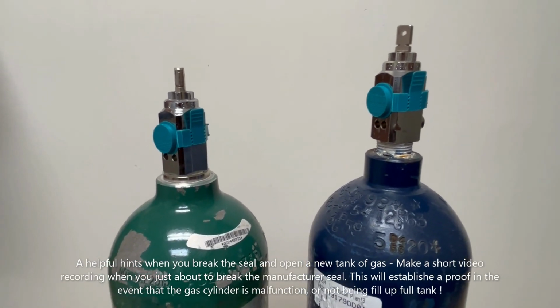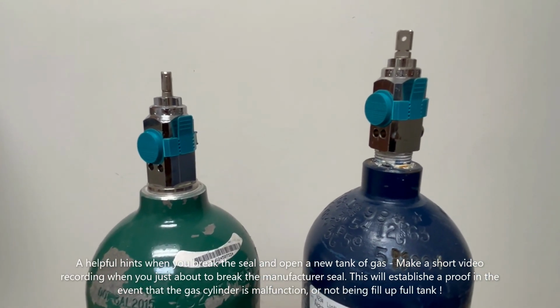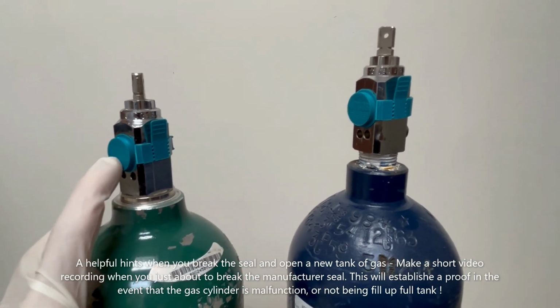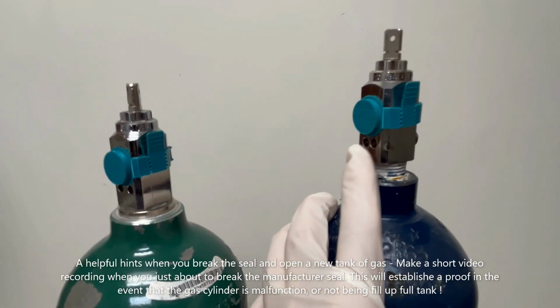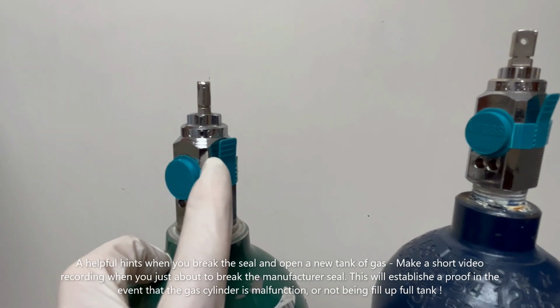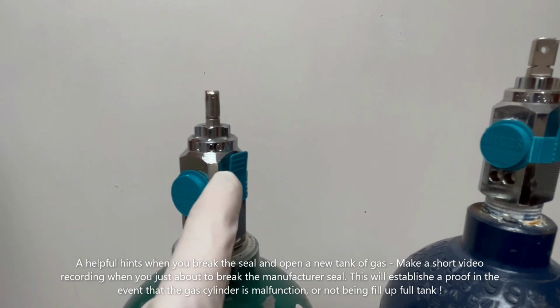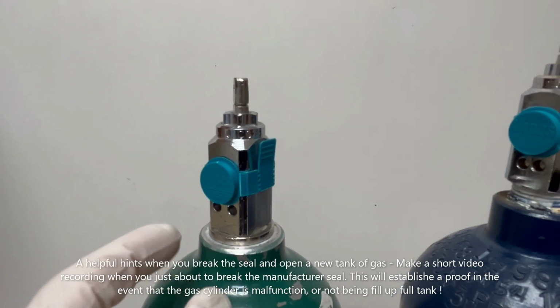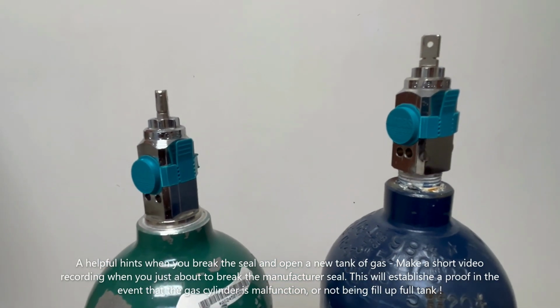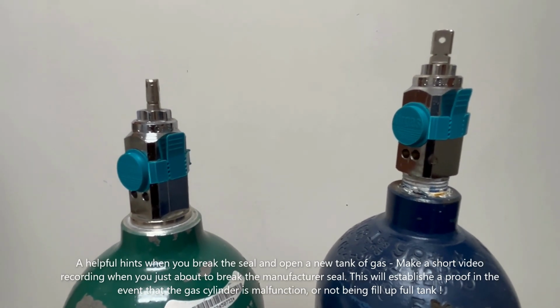Here are examples of two new cylinders when you receive them from the air supply company. You see there's a manufacturer seal tab there. One of the helpful hints before you open the seal, I would suggest you make a short video, about a minute long, to show that you're taking this tab off and mounting it into the mobile unit, and then turn both of the units on to see if the pressure gauge is full or not.